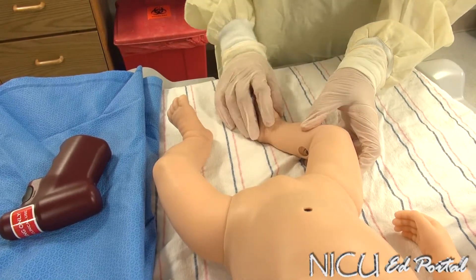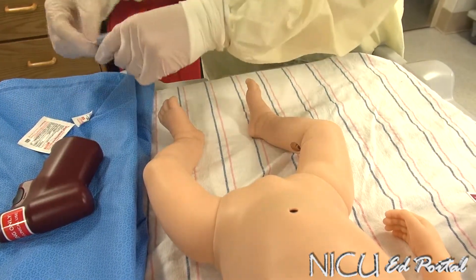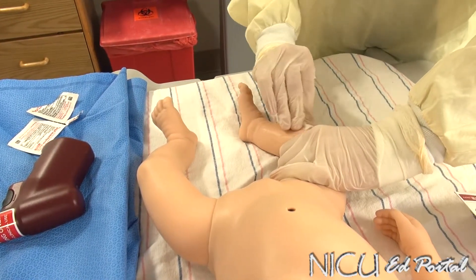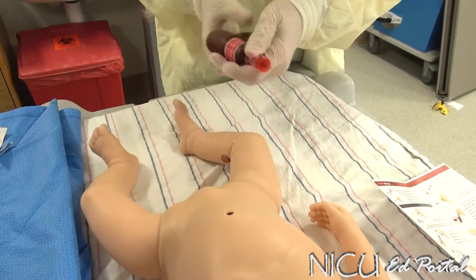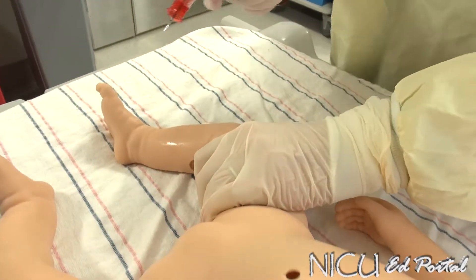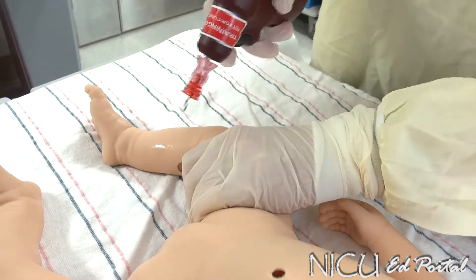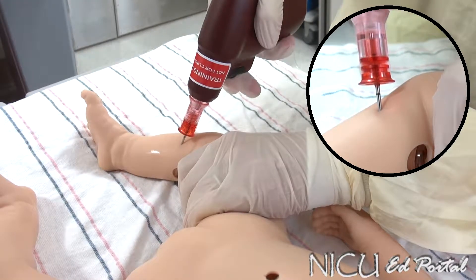After I identify my anatomy, I'm going to remove the safety and expose the needle, then put my equipment together. I'm going to remove the needle, being careful not to place my fingers below the area that I'm drilling. I can re-identify my anatomy, and aim at close to a 90 degree angle, but slightly angled down, away from the growth plate.